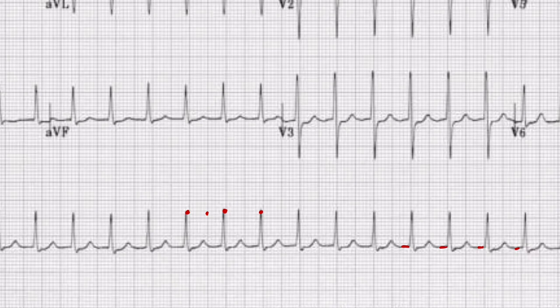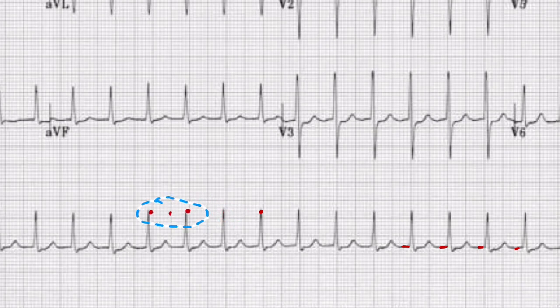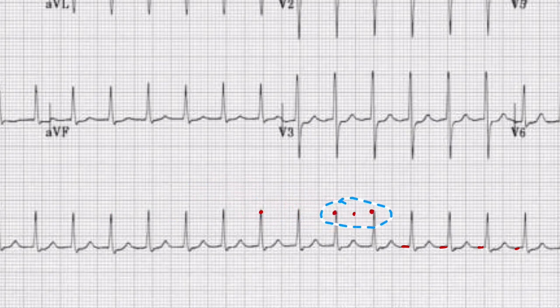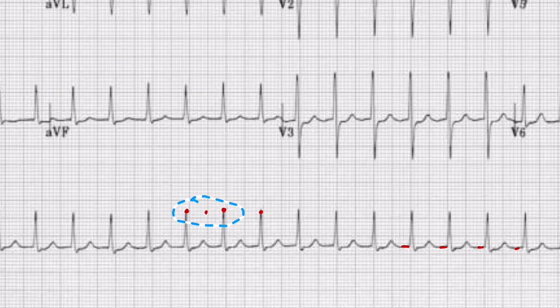Next, we're going to look for the rhythm. We'll take these markers and move them across the rhythm strip. We can see the intervals are about the same distance all the way across, so we can say that this is a regular rhythm.